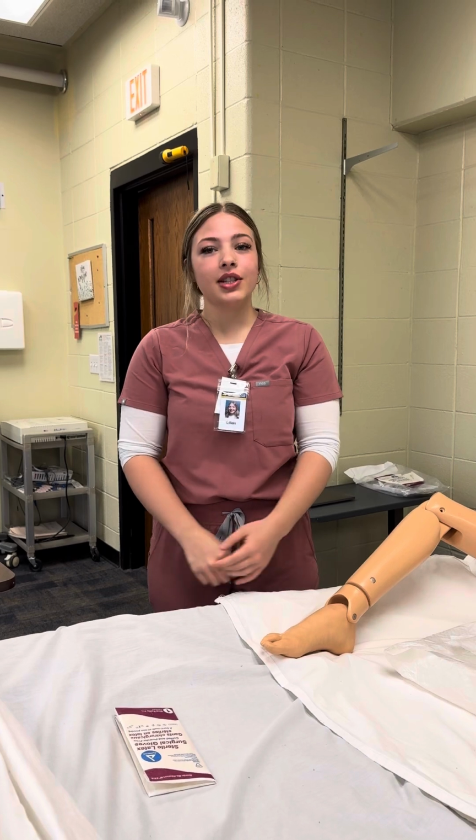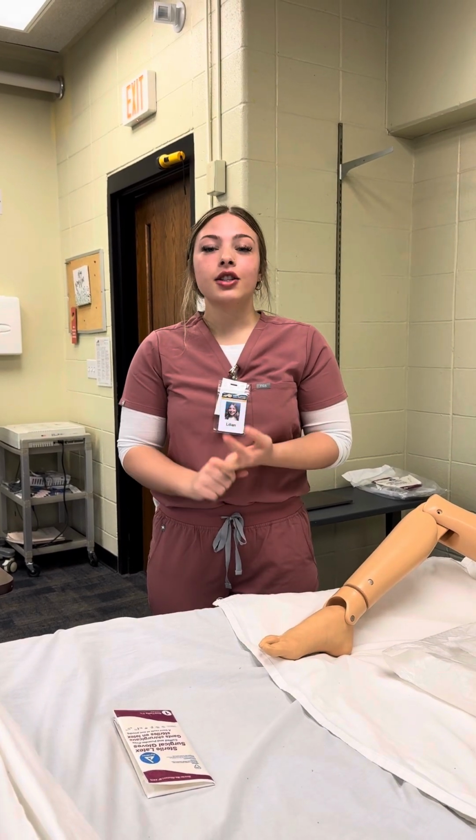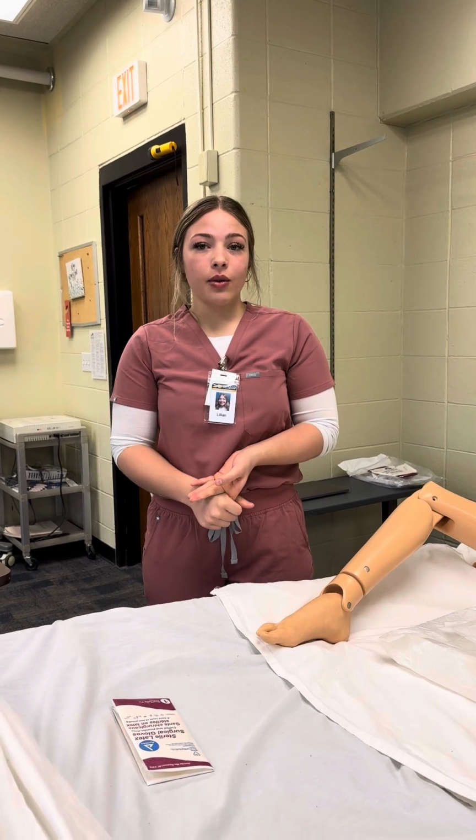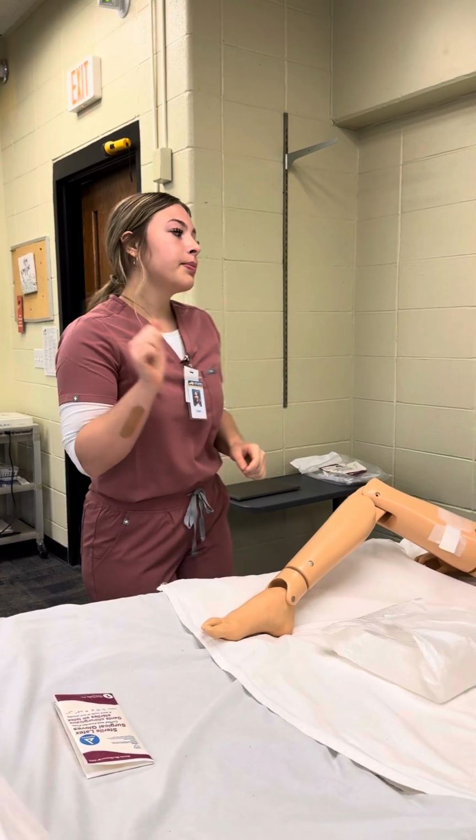Before I get started, I'd be sure to follow my GPSPs, do my 2 patient identifiers, assess for allergies, and verify the order. So I'm going to go into the patient's room.